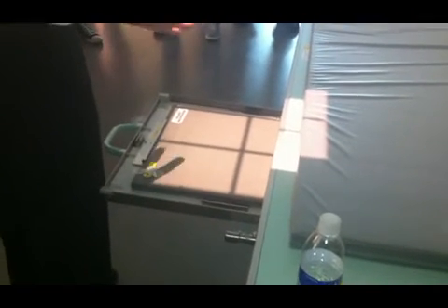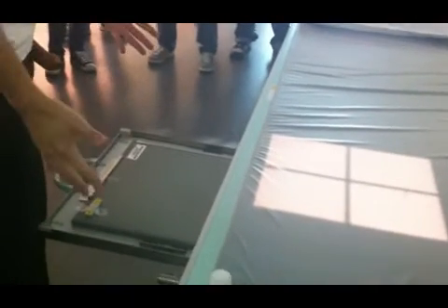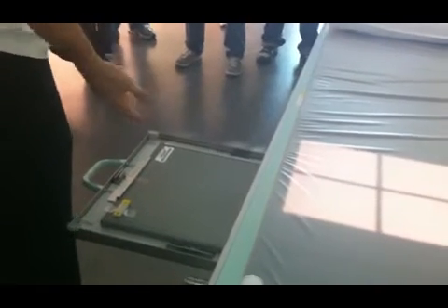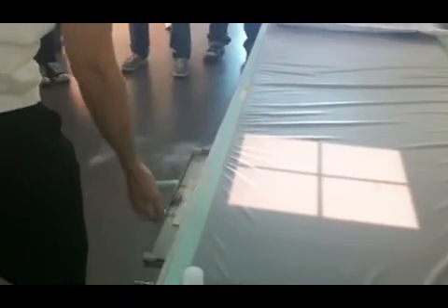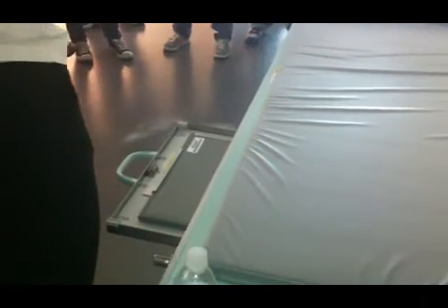Okay? So when you do this, the natural tendency of some techs when they get the patient on here, especially if it's a big patient, is they will open this up a little bit. Okay? If you open it up, you're going to be past the lines that you can use, past the usable limits. Okay? It's not going to help you. It's only going to throw off your collimation. Okay? Throw off your centering as well. Okay? It's marked. So set in transverse.